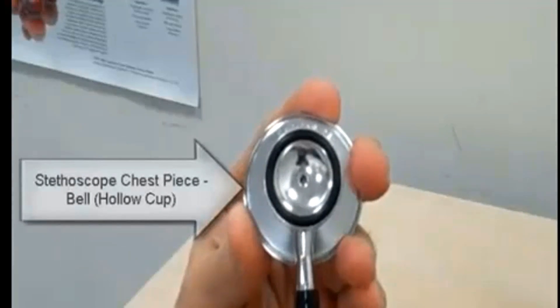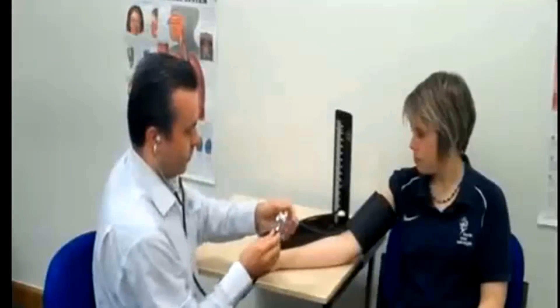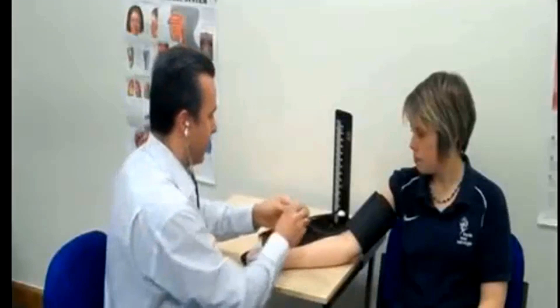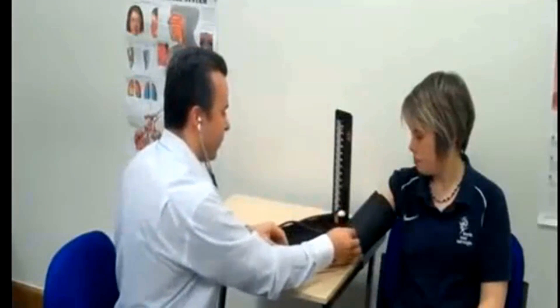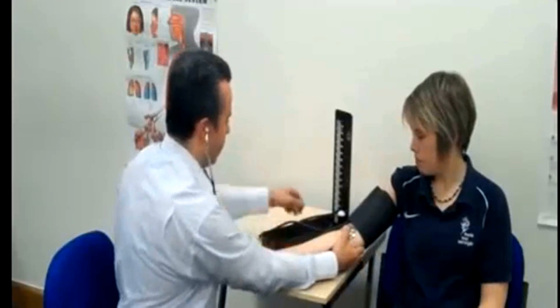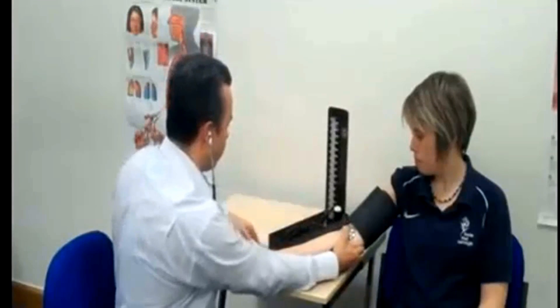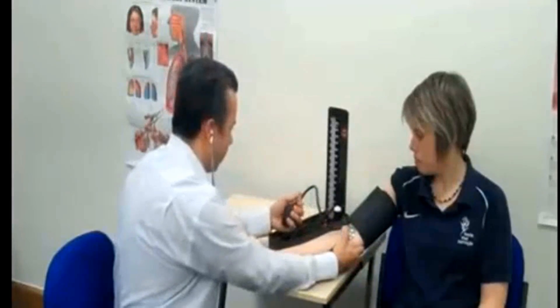Position the stethoscope. On the same arm where you placed the blood pressure cuff, palpate the arm at the antecubital fossa to locate the strongest pulse sounds, and place the bell of the stethoscope over the brachial artery at this location.